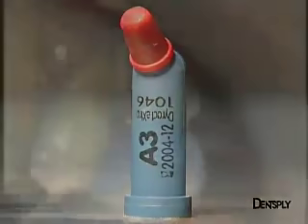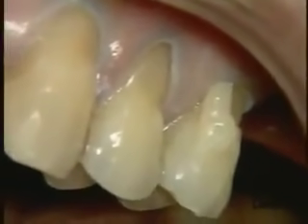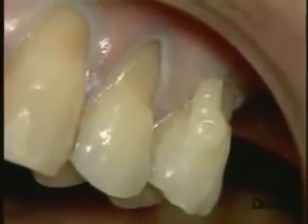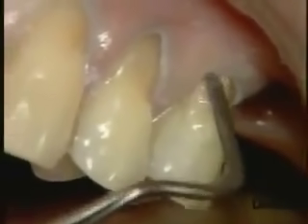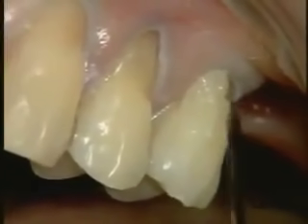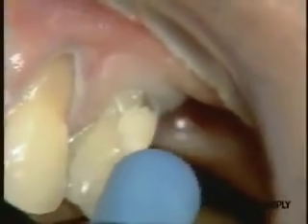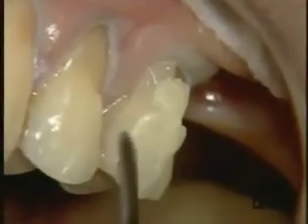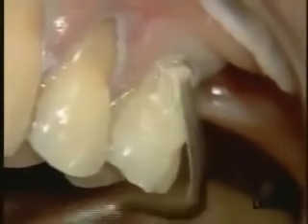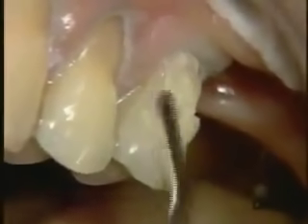We start by filling the premolars, and we select the shade A3. The first layer allows us to sensitively rebuild the second premolar. The material is applied under steady pressure to avoid any air inclusion within the resin. Each increment is light cured. There will be excess material at this stage that can be removed with finishing burrs. It is important to ensure that we place enough material in the cervical area, since this will affect the cosmetic appearance. A spatula is used for all these operations.